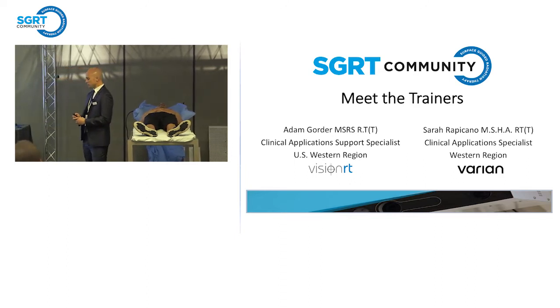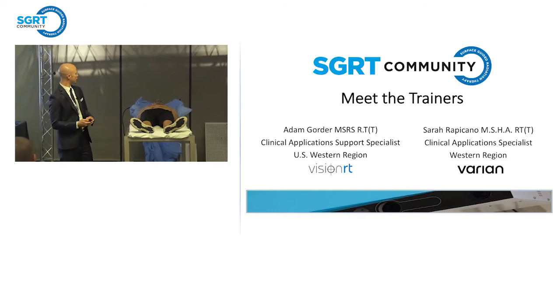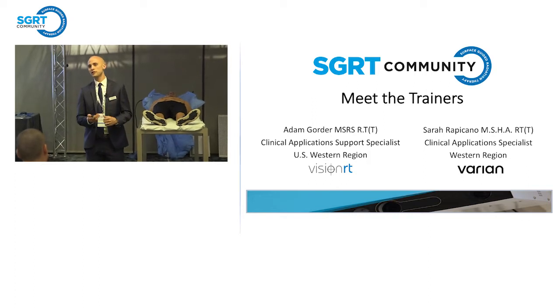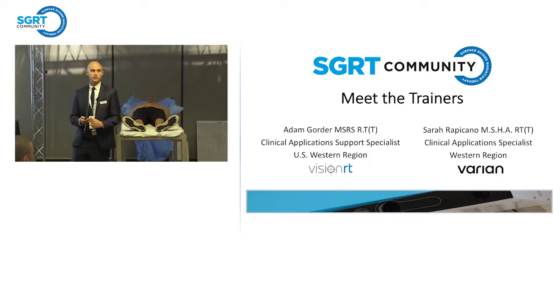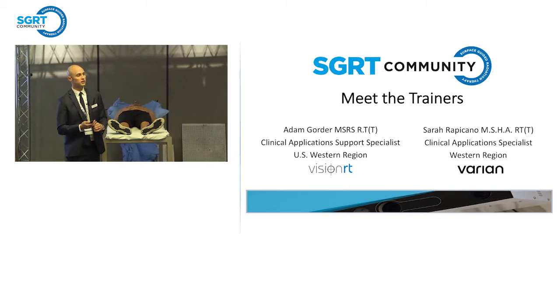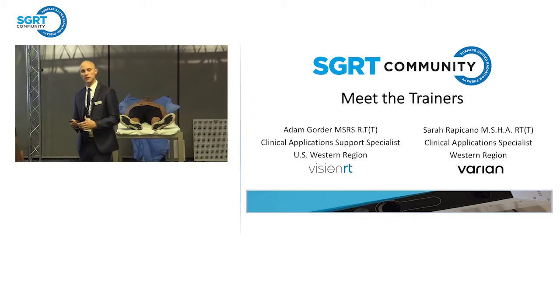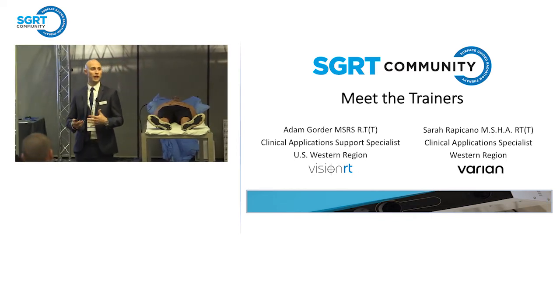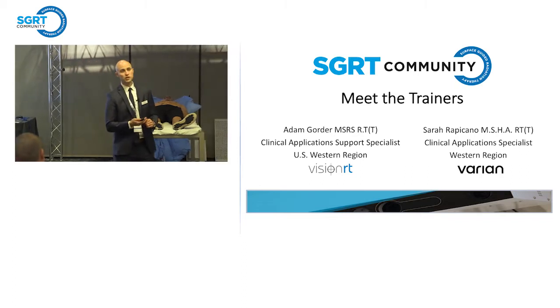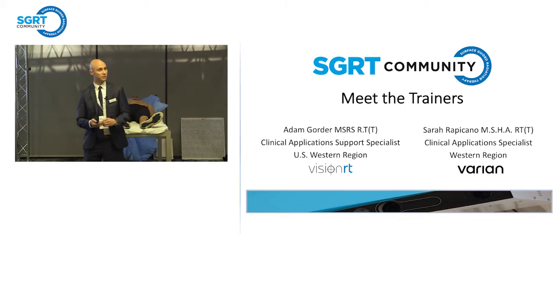Before we get too in depth here with our session today, I just want to give a brief overview of the surface guided system and what it is. There are two major modes that we're concerned with in Align RT and OSMS. The first one is record mode. The second one is treatment mode. Record mode is basically the treatment planning process for Align RT, getting all of the patient information in so that we can use the system. Treatment mode is what our therapists are going to be using on a daily basis while they treat the patient.